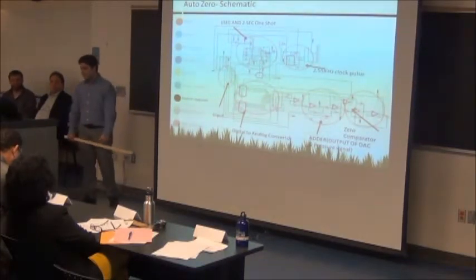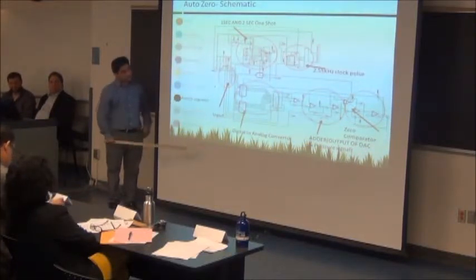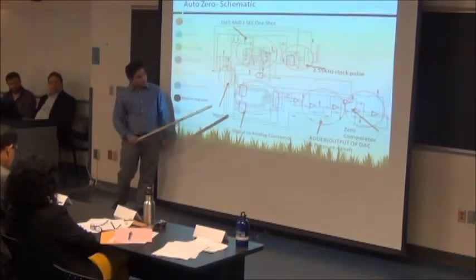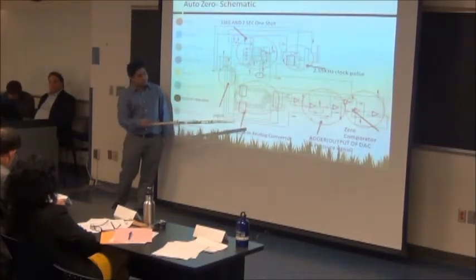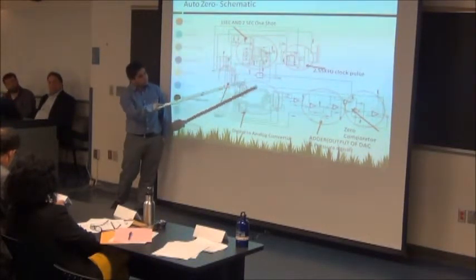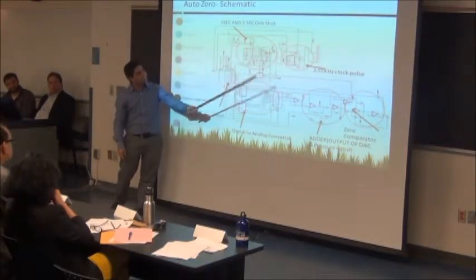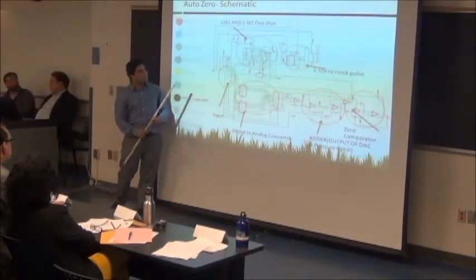And this is the schematic. As I said, this is the input. It's going to take a pressure signal at the input, and the pressure signal will go to the adder right there, and it's going to add with the DAC, the digital to analog converter here, and it's going to compare until it detects the zero. So basically the whole cycle of comparing the zero is controlled by this generator pulse control circuit.